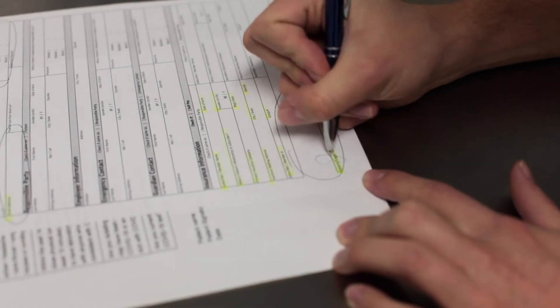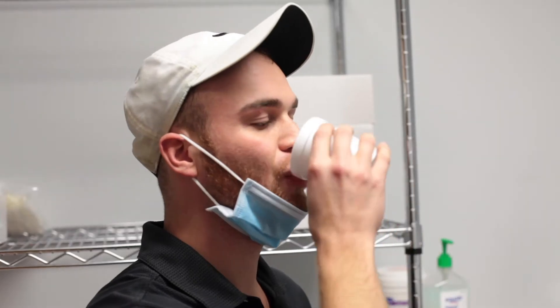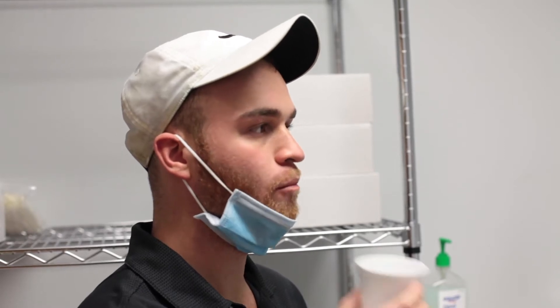To begin, make sure the patient has completely filled out all necessary forms. To help get rid of any cross-contamination, have your patient gargle a warm cup of salt water.